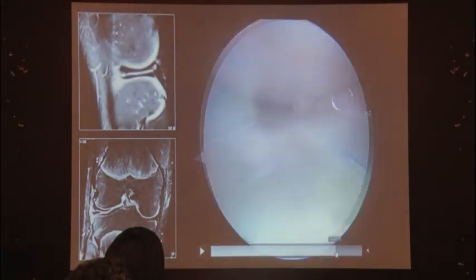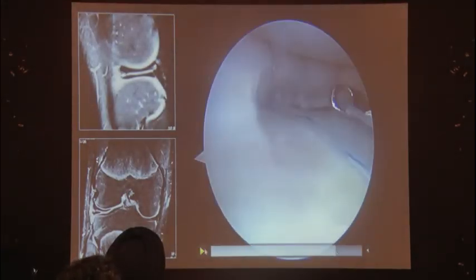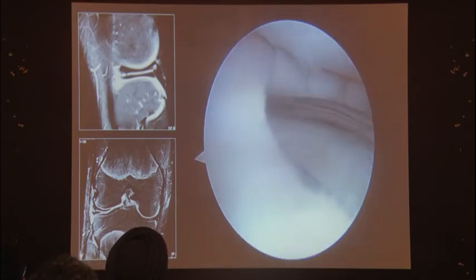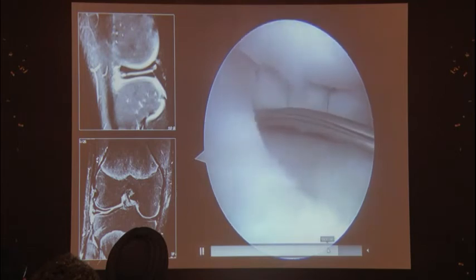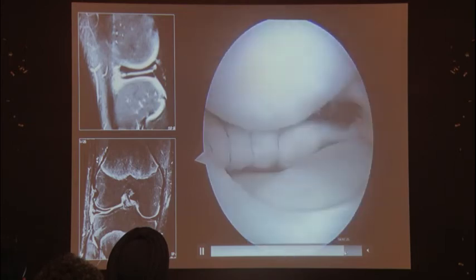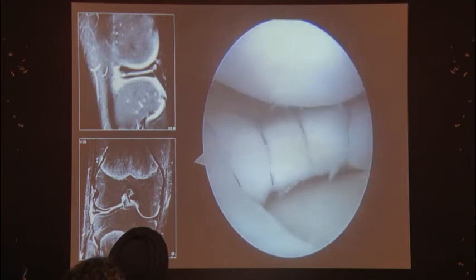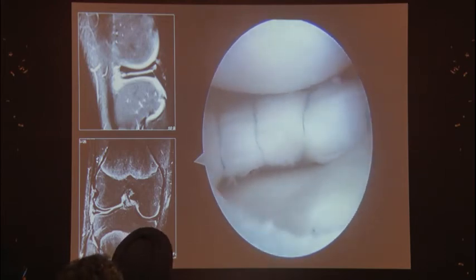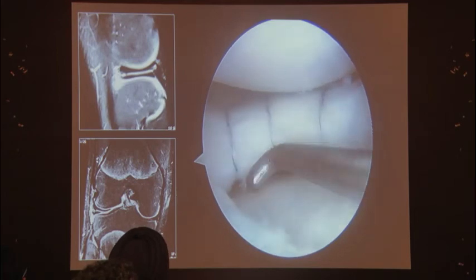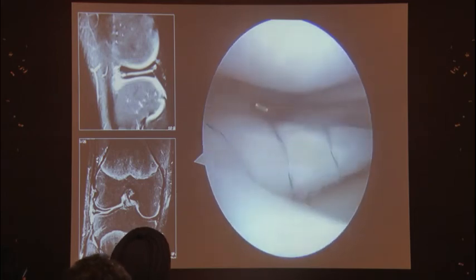All you need to do is go ahead and tie them down. You take the third and then the fourth suture, tie them all down, and you've achieved a complete saucerization of your discoid lateral meniscus with four circumferential compression sutures — very easily placed with this device, and very difficult to place with any other device.